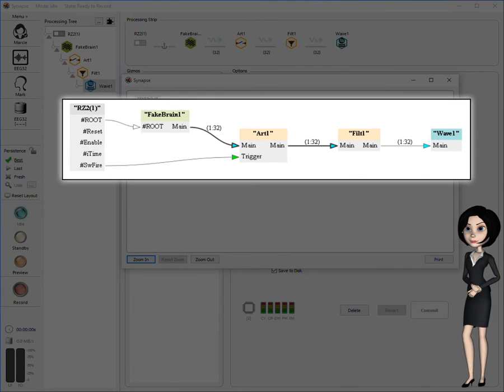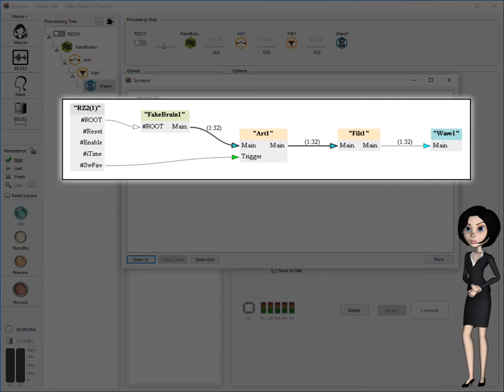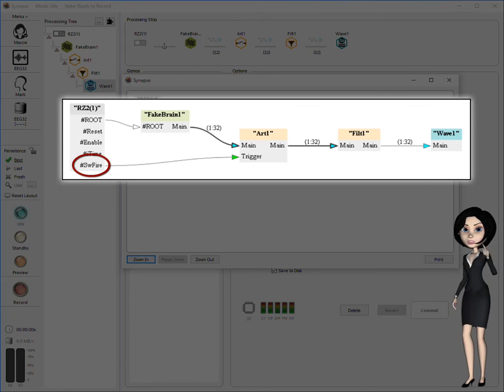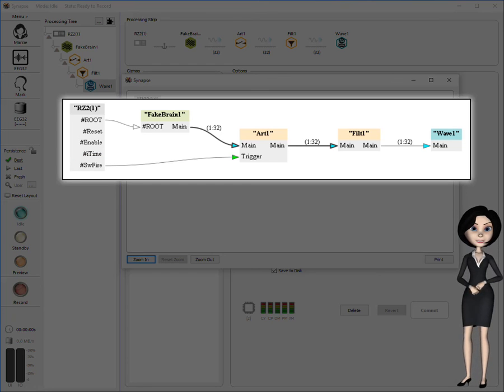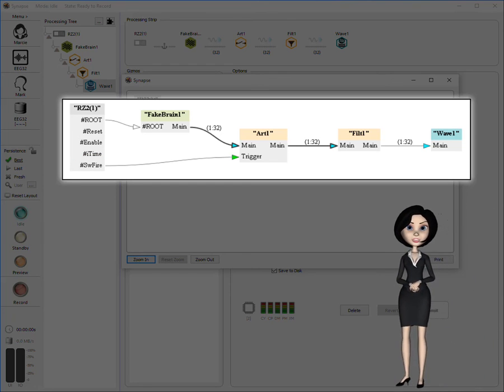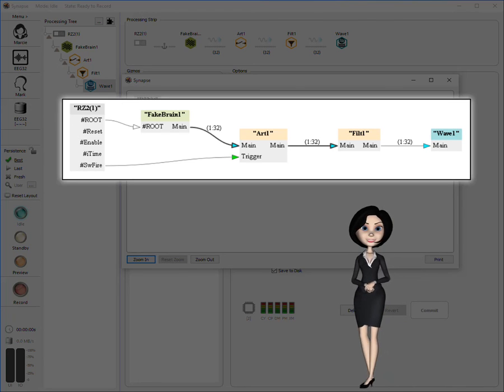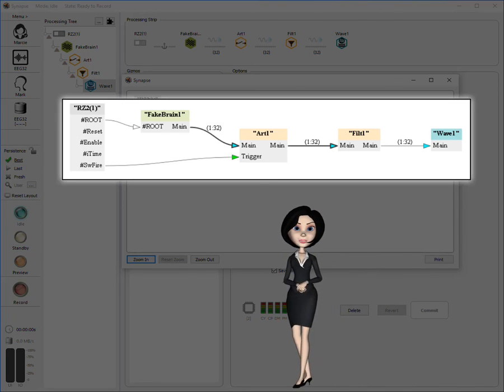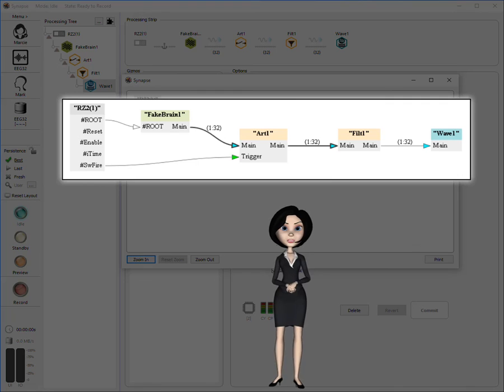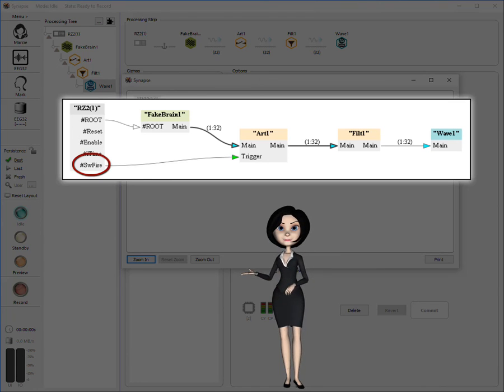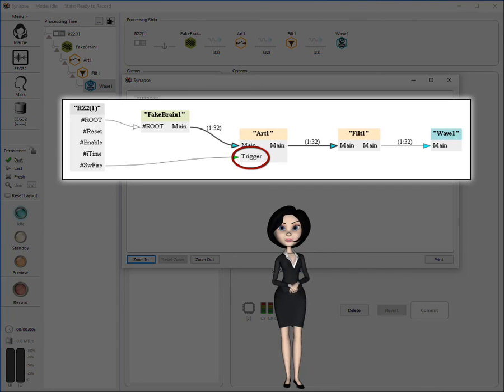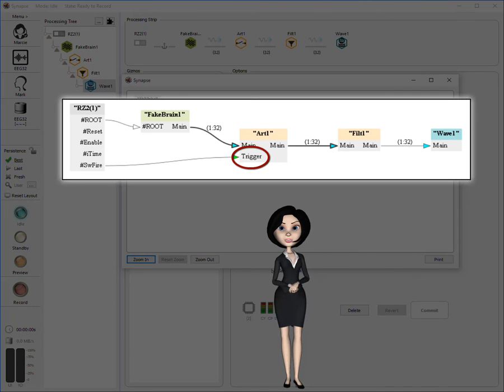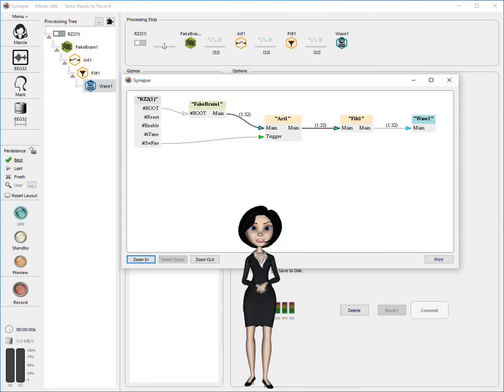Notice that the trigger input for the artifact reject gizmo is connected to something called sweep fire. Sweep fire is a system-wide logic signal that ticks once every second while your experiment is running. When a gizmo is added to an experiment, Synapse will try to connect its inputs to appropriate source signals. If none can be found or multiple choices exist, a selection dialog will appear when the gizmo is added. Here we see the system chose sweep fire as the most reasonable connection for the trigger input. In part 3 of this demo, I'm going to show you how to reconnect the trigger input such that it suits the needs of our experiment.